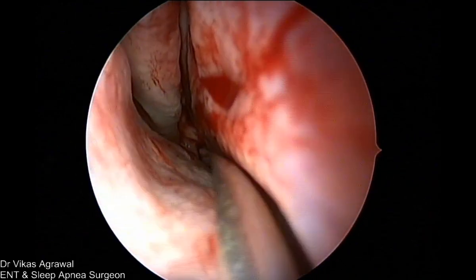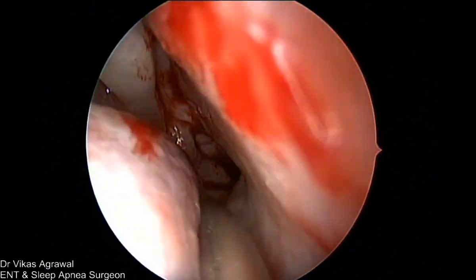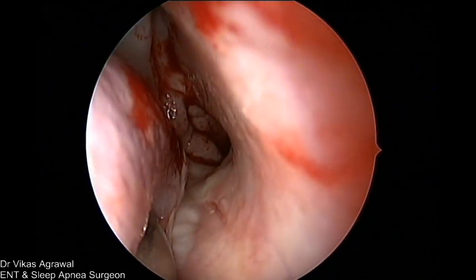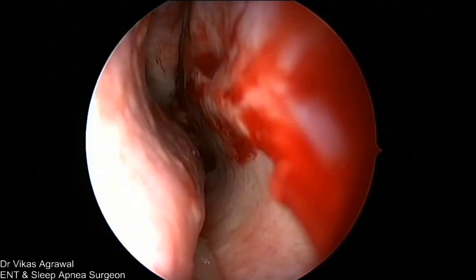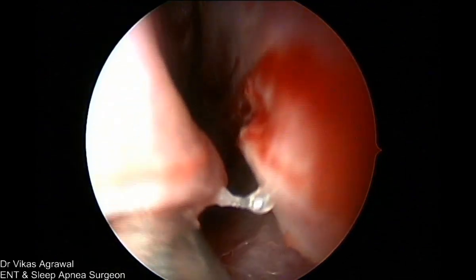Now see, this turbinate has got 3 parts. This part is totally polypoidal. As I told you earlier, the posterior part is completely polypoidal. And you see how much of secretions are forming here. The lower part is polypoidal in the whole extent. There is no bone here. So this will keep on reacting to allergy.